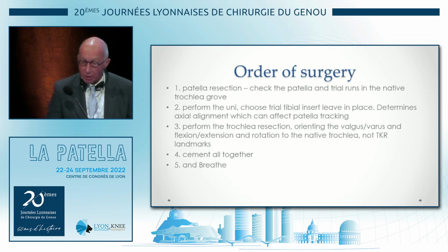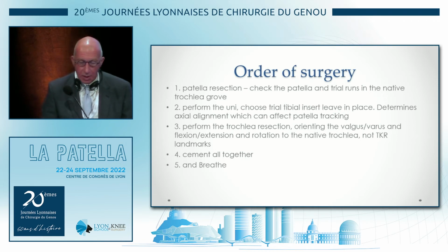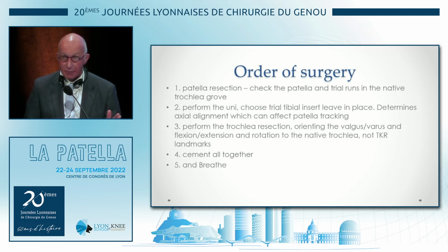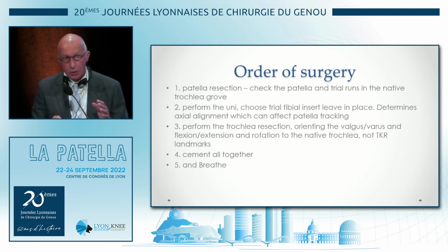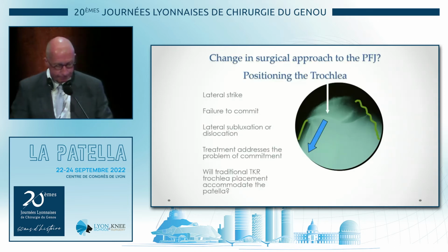I check the patella runs in the native groove, and then I actually do the uni, because that changes the alignment, the varus valgus alignment of the knee, which alters the patellofemoral tracking, which alters the trochlear position. So you just heard what Seb said about putting the tracks underneath the train. Whoever thought about that was very clever.